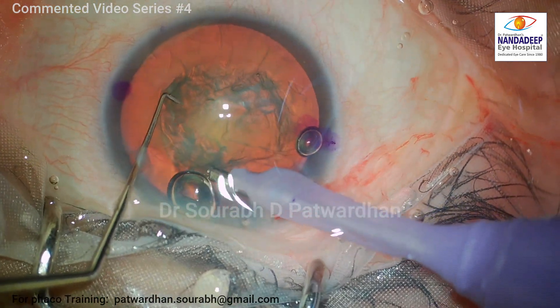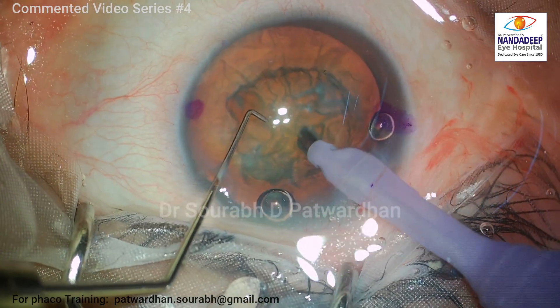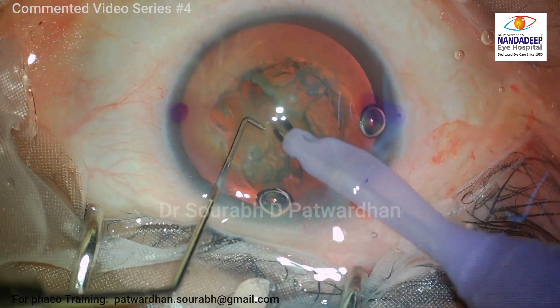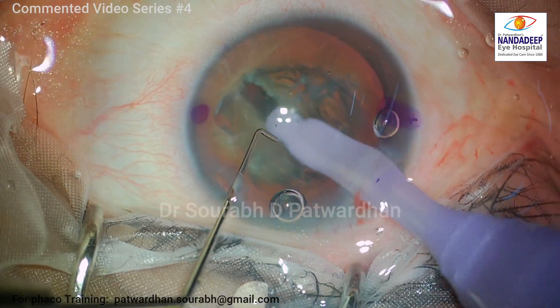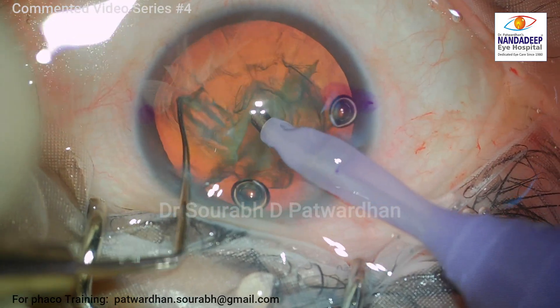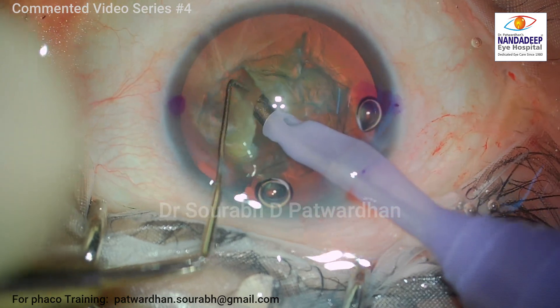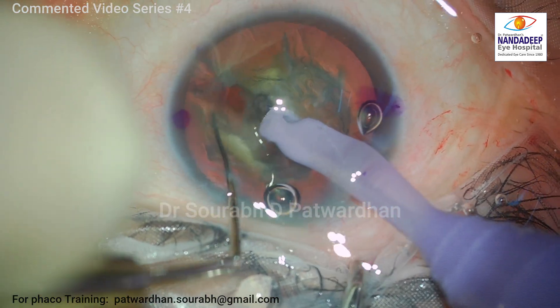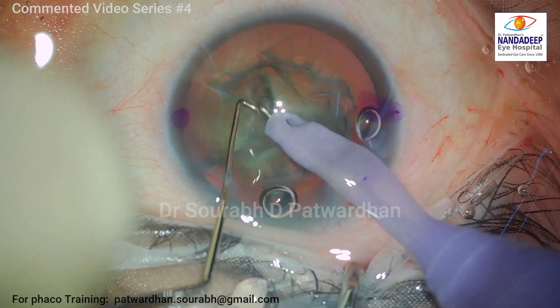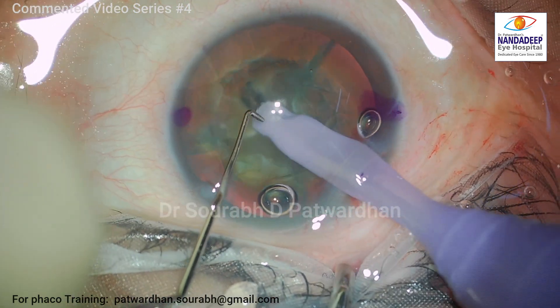Your instruments may find it difficult to reach the depth, particularly if you are doing trench divide or chopping. What I want you to see here is that you don't see my fingers in the video because I am holding the sinskey away from its tip. That's why I can slide it much deeper into the trench as I divide. Don't try to hold the instruments too close to the eye, as you may have difficulties maneuvering in deeper anterior chambers.